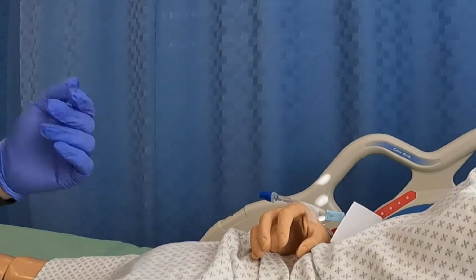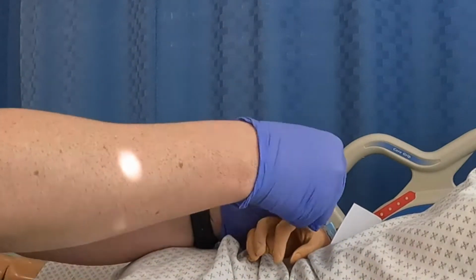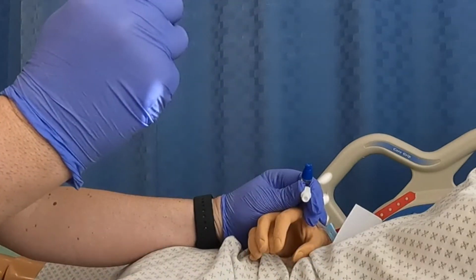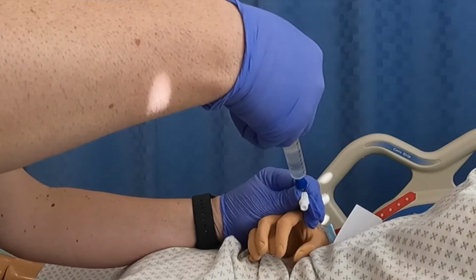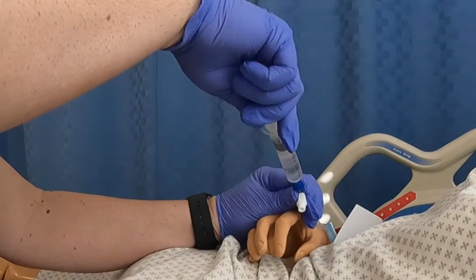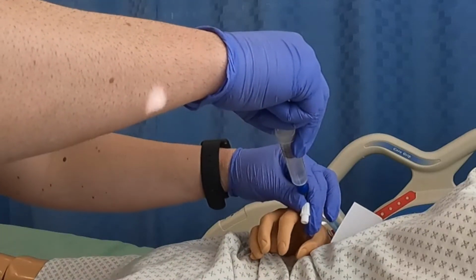Okay, so now I'm going to show you how to hook up the IV. So we have our port here, and we want to make sure that we do a really good job of cleaning this. And then I have my saline syringe here, and I'm going to make sure I got all the air out, and I'm going to go ahead and do a little flush. Again, making sure that there's no redness, tenderness, no pain, no difficulty pushing this fluid through, no complaints by the patient. I'm also going to draw a little bit back to see if I get blood return. I do get some blood return in my IV, which is great. So I have a very patent IV.